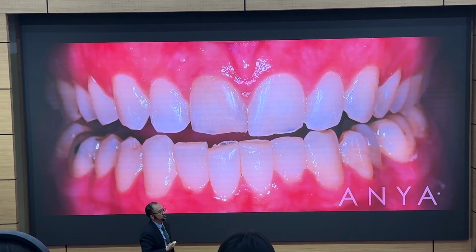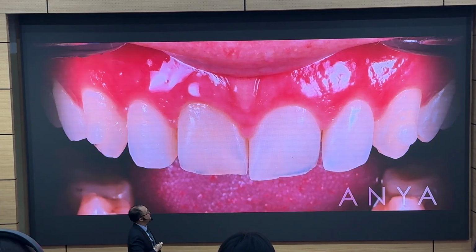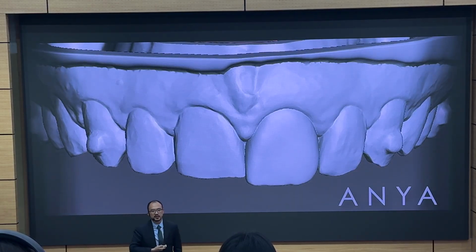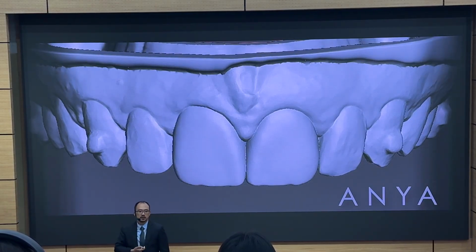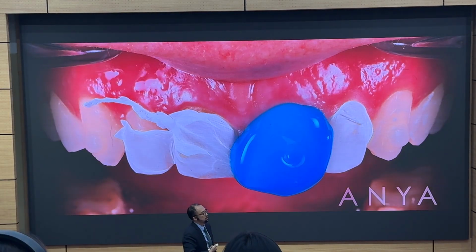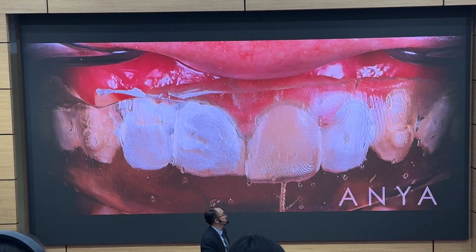After we did some orthodontics, we did a scan, and we built up the tooth. We did 2 build-ups. 1, 2. And then using this build-up, we use the GC Exit, which is a clear putty or a clear matrix system that looks something like this.